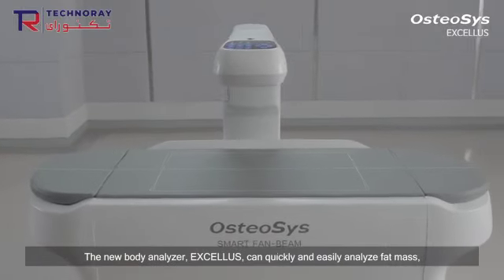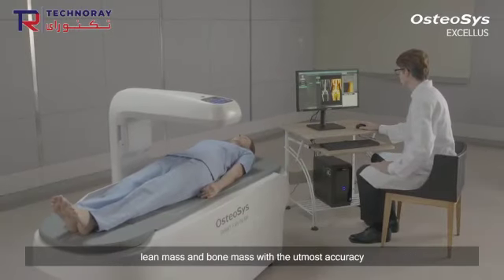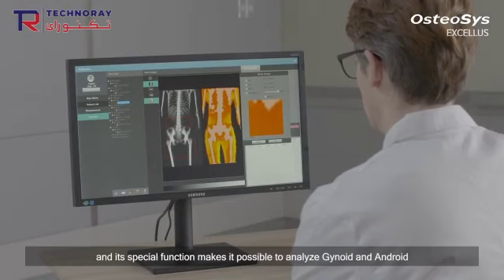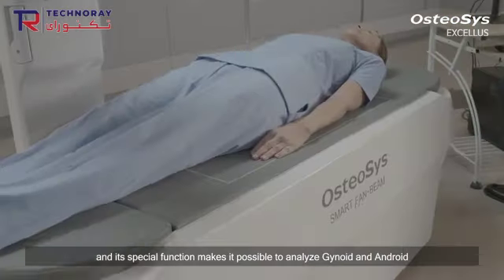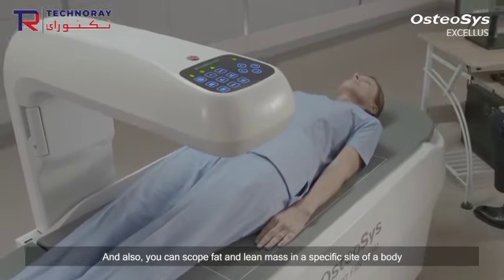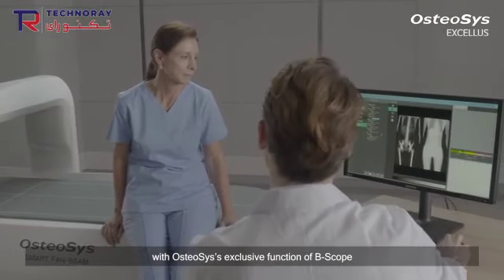The new body analyzer EXCELLUS can quickly and easily analyze fat mass, lean mass, and bone mass with the utmost accuracy. Its special function makes it possible to analyze gynoid and android, and you can scope fat and lean mass in a specific side of the body with the OsteoSys's exclusive function of B-scope.